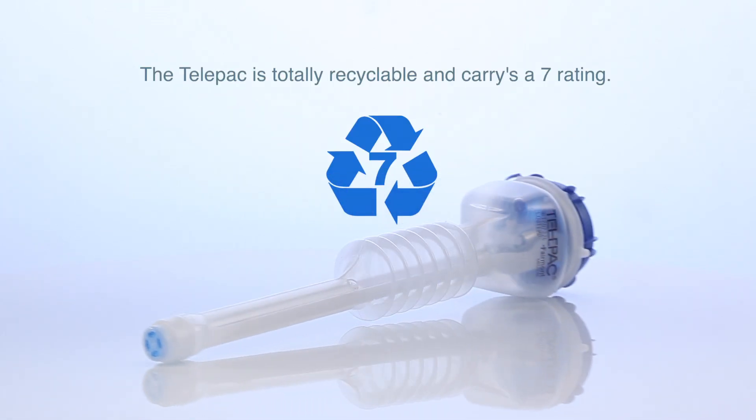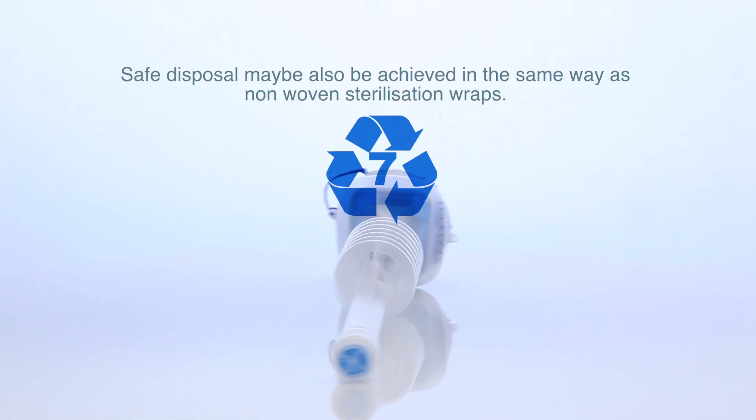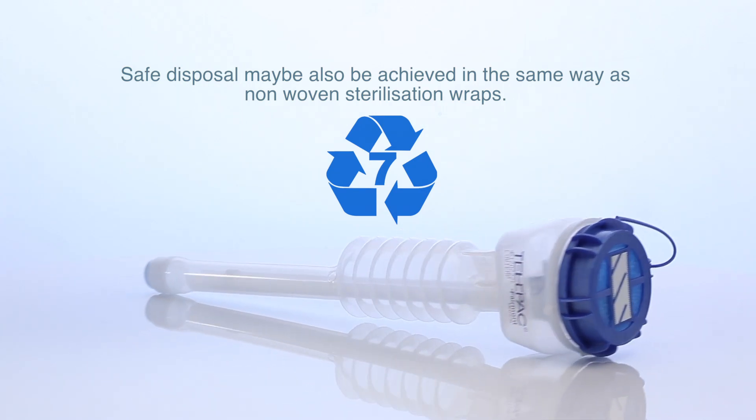The Telepack is totally recyclable and carries a 7 rating. Safe disposal may also be achieved in the same way as non-woven sterilisation wraps.